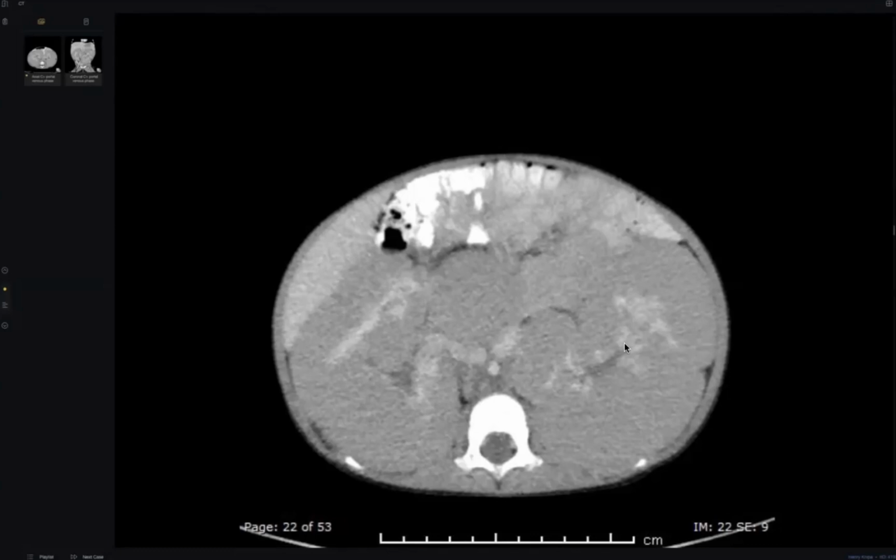I ask you a question. What is the expected management and why? I will ask you the same question, but in another way. What is the expected complication of this nephroblastomatosis? Sir, there is a complication to convert this nephroblastoma tissue into the Wilms tumor. Excellent. So follow-up imaging is recommended.